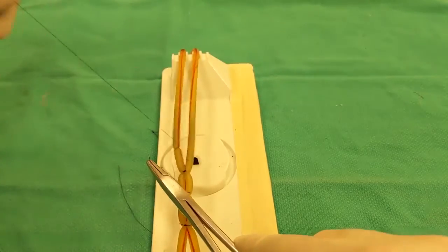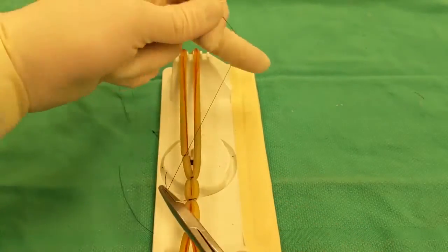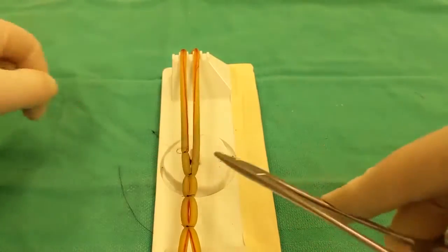So you want to tie it nice and tight, and you'll throw another one to create a square knot to lock that ligation. Then you'll put another square knot on top to make sure the ligature doesn't slip.